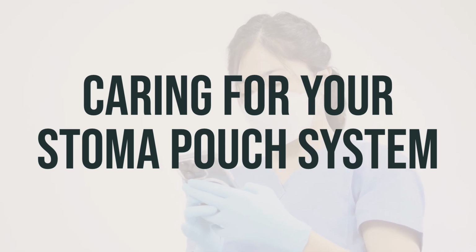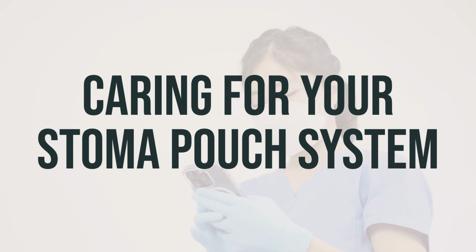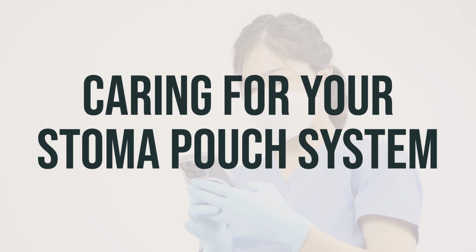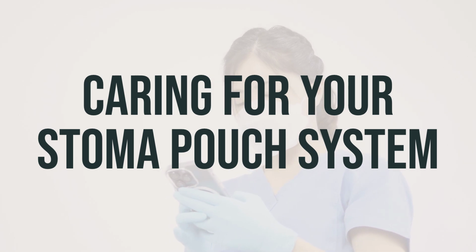Today's stoma pouches are designed to be odor-free, but if you notice any odors, there are products you can use to help. Some pouches have carbon filters to prevent smells, and you can also use deodorizing drops or charcoal tablets. Just be sure to check with your doctor before trying any new remedies.